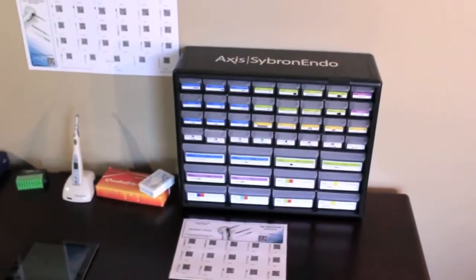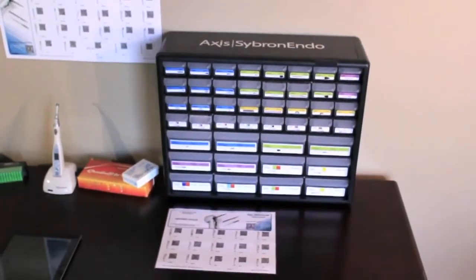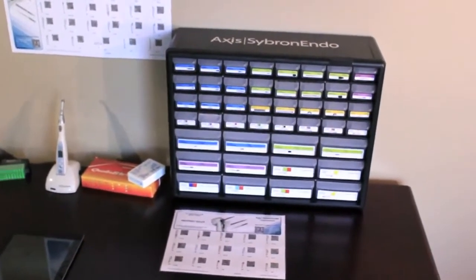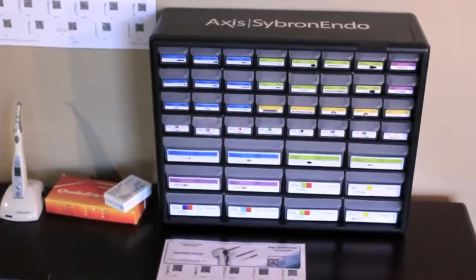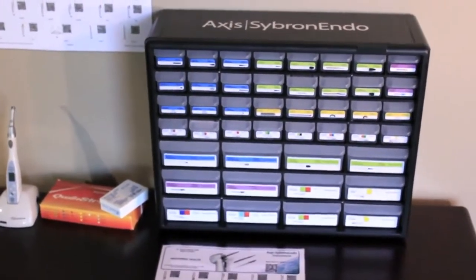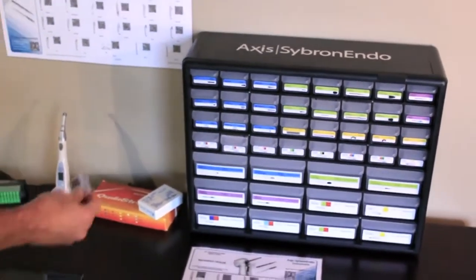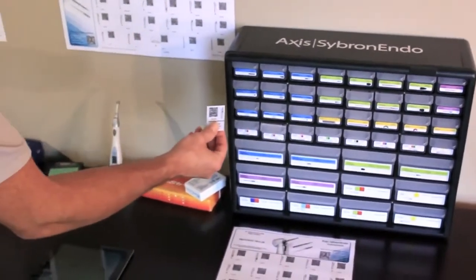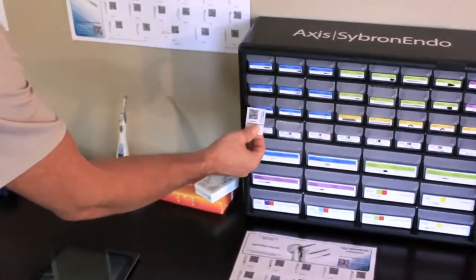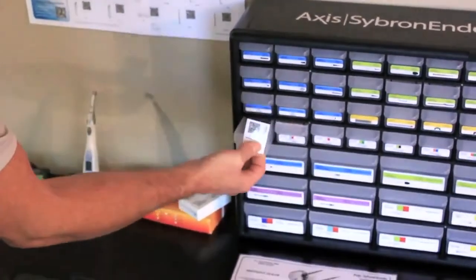Our organizer cabinets come with convenient color-coded labels to neatly group your instruments, and the included QR Code drawer inserts provide the same scan-to-order feature for each product as the wall charts.